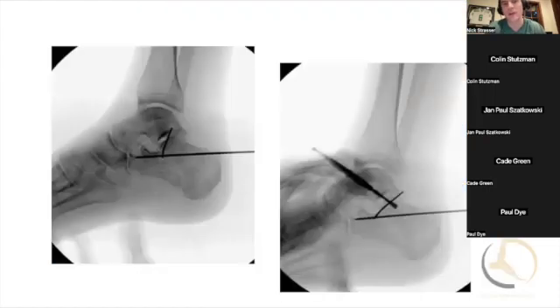You can see there's a K-wire that was placed in that posterior piece. It was lifted up and then advanced forward. I oftentimes will use a joker or a freer through that sinus incision to help lift that piece up and dial in the reduction.